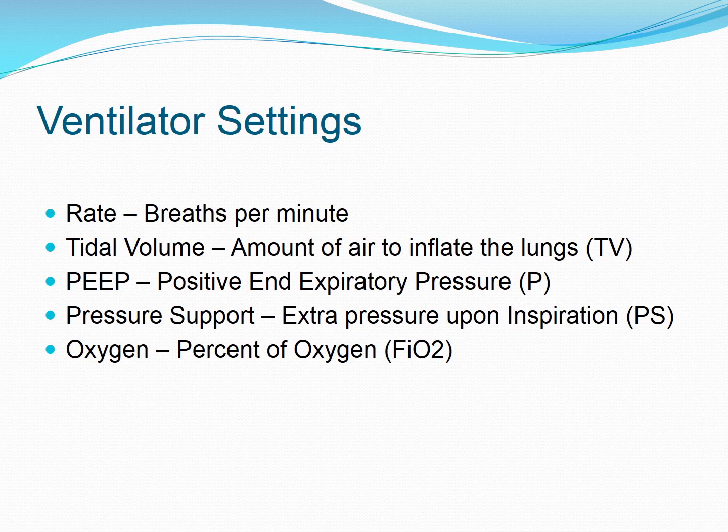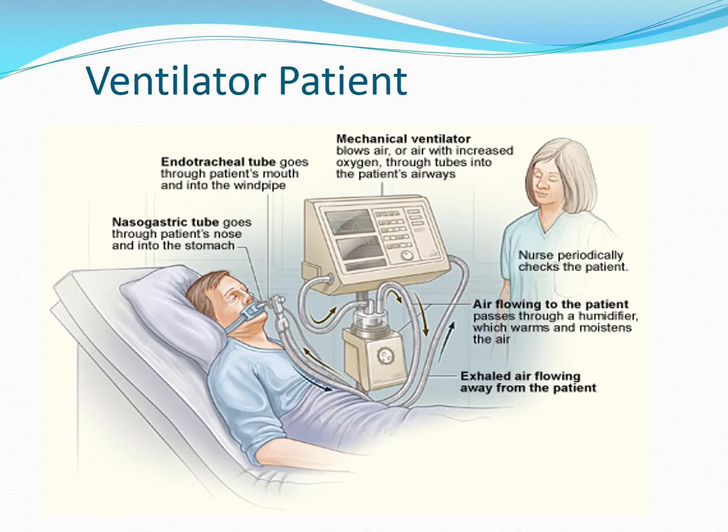As I said, one of the concerns with FiO2 is if it's greater than 40% for an extended period of time, then the patient's lungs can become damaged, and then there's less oxygen available or less surface area available for gas.